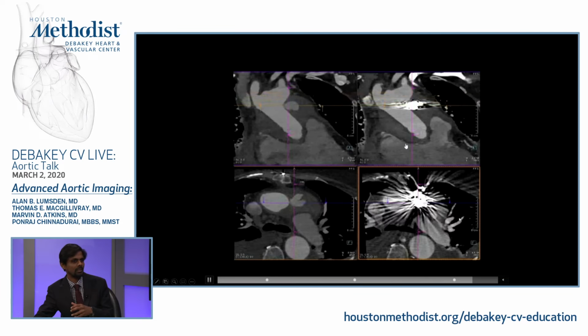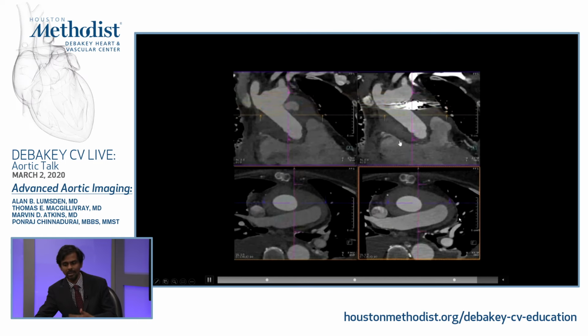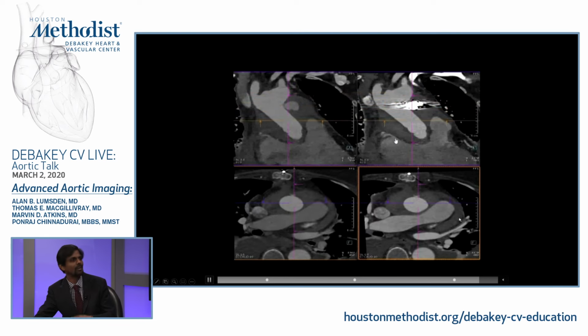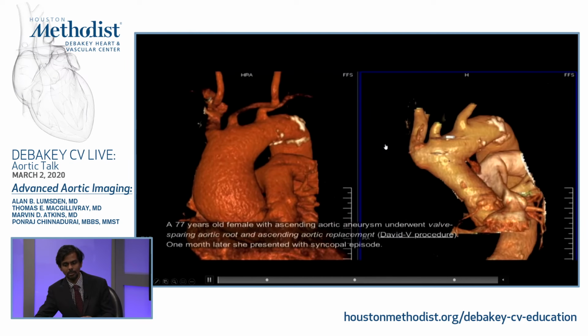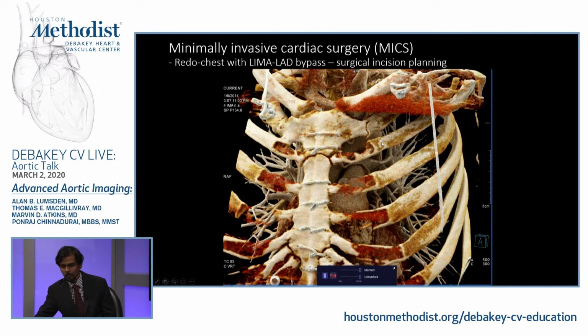Because we have been doing all this imaging in the OR, we were able to push the envelope and do this and save this patient from a potential redo surgery. And she's now a year out, so it's not just show and tell in the short-term outcomes.